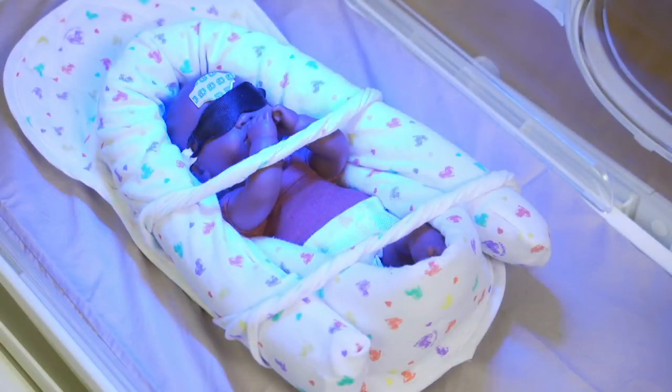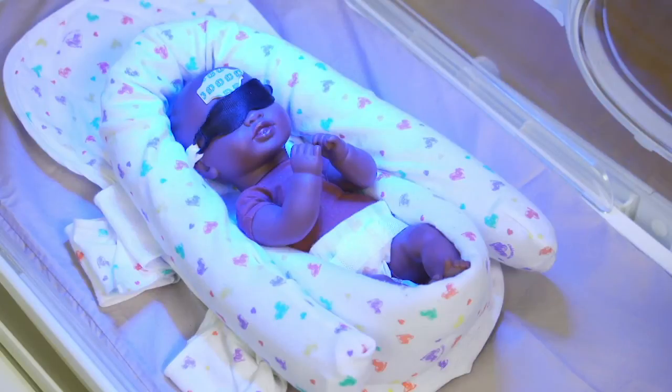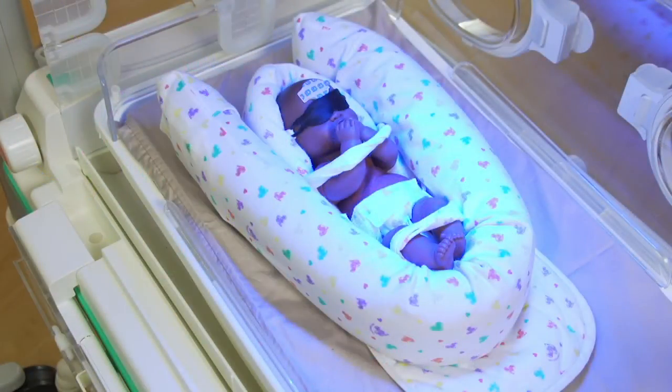During phototherapy, if overhead lights are in use, twist the straps to make them smaller and minimize the amount of space they occupy, or remove them and tuck them under the snuggle-up. If panel phototherapy is in use, you may turn the snuggle-up around and use a bendy bumper at the feet to accommodate the cable between the panel and the light source.